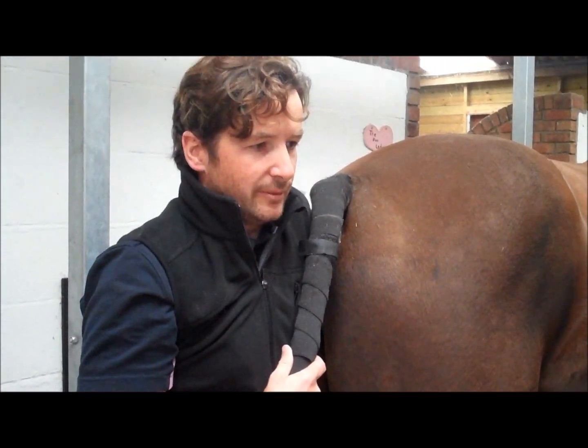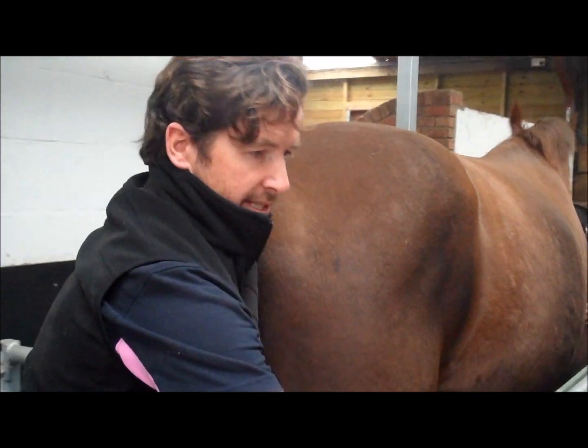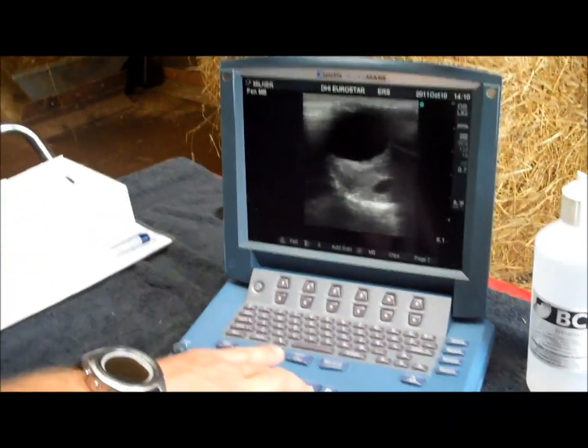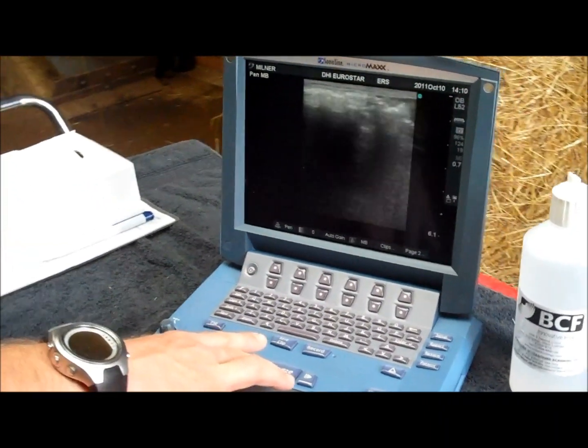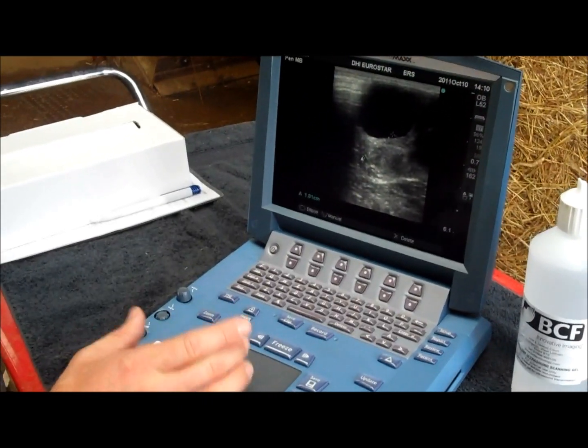Look at this mare's ovaries. We can palpate and then scan her ovaries. And this is how easy it is to freeze and save an image — so we can have a follicle, acquire the nicest image we can of that follicle. There we go. To make a measurement, use the caliper button.